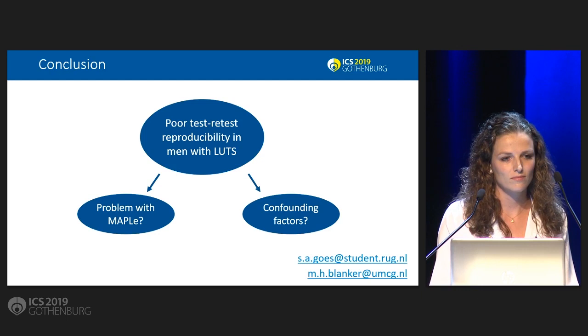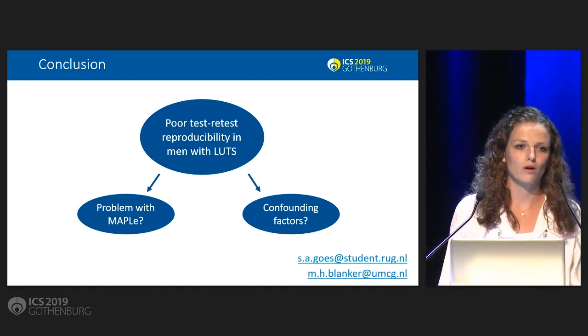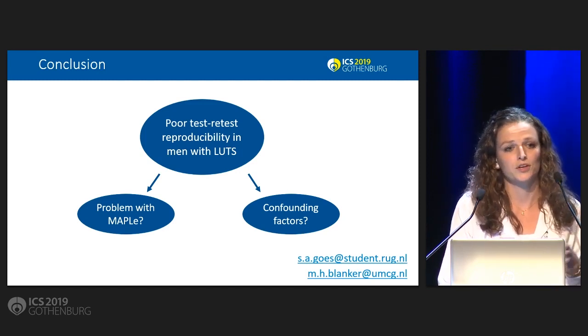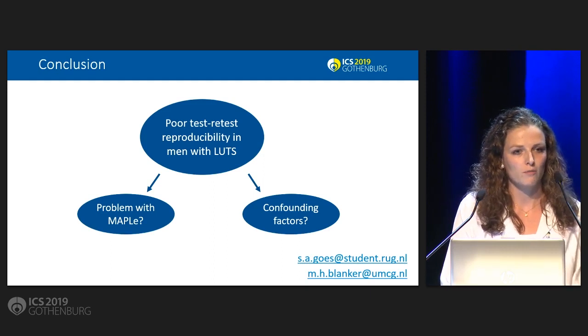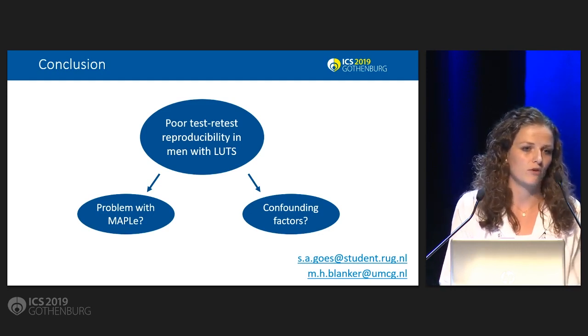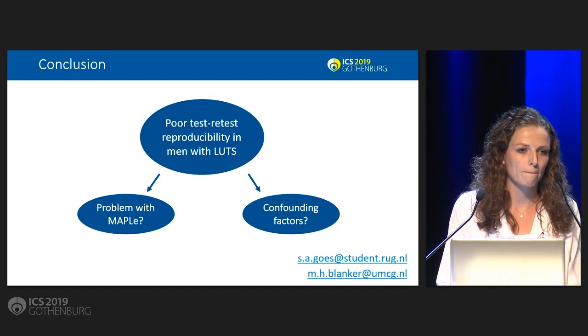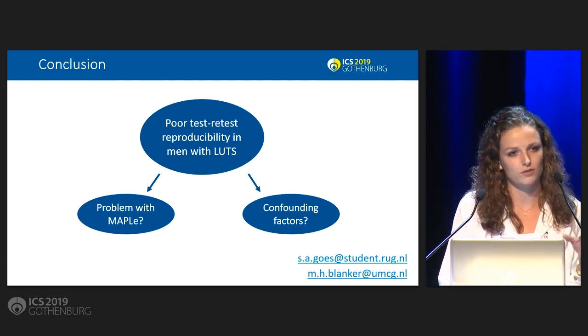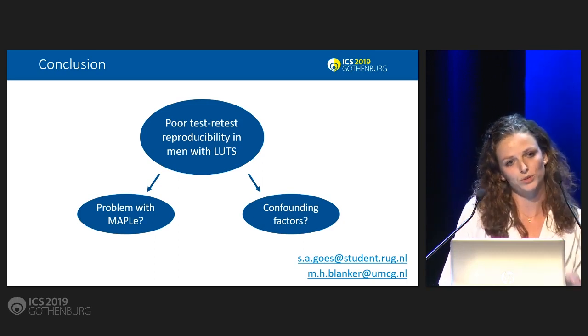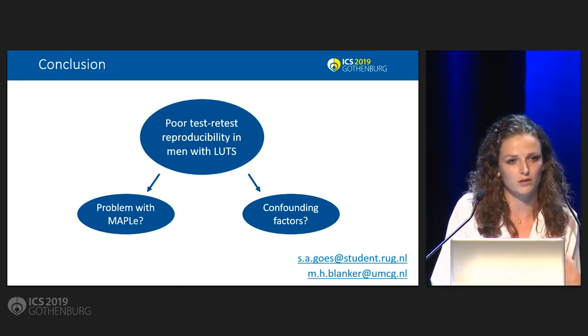I have a question about how the men did the assessment. Well, we had 4 medical students who did the assessment for all the participants, and they did it according to your protocol, and they received training by you guys, and they followed those directions and that protocol. But if I'm correct, the probe was not always held in place, right? No, that's correct. If it seemed like it was in place, then fine, but if it was coming out, they pushed it back. But that was according to the manufacturer's protocol as it was delivered and approved.